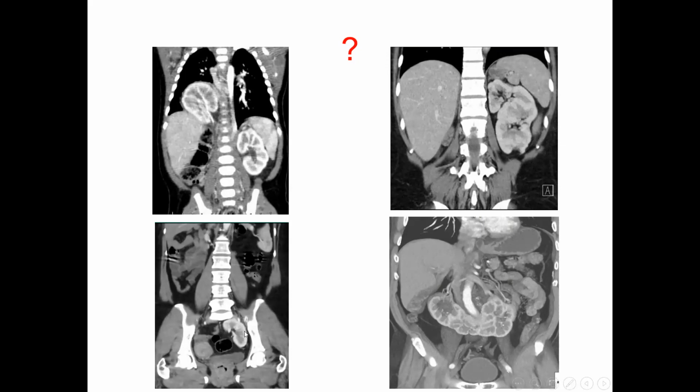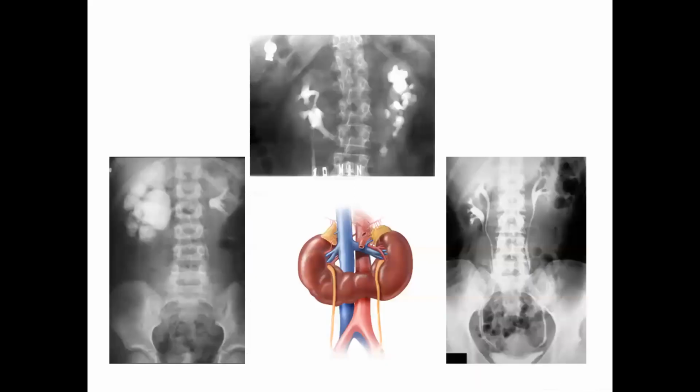This one? No, it's not transplanted. It's the left kidney is not there. So congenitally, it's an ectopic kidney lying in the pelvis. Like you have this in the thoracic cavity, it's lying in the pelvis. But it's a good observation. The transplanted would also be lying somewhere here. But you would see the native small kidneys here. You would see atrophic small kidneys of the person getting the transplant.